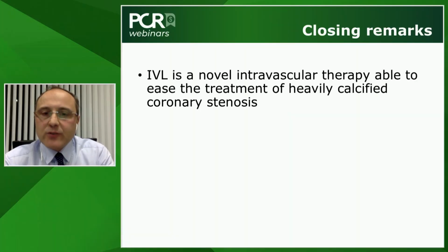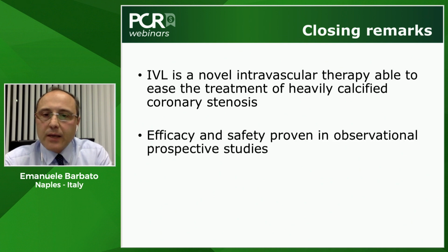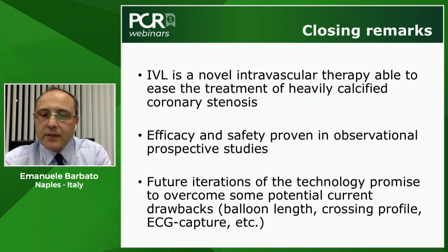Intravascular lithotripsy is a novel intravascular therapy able to ease the treatment of heavily calcified coronary stenosis. The efficacy and safety have been proven so far in observational prospective studies. We have seen and discussed in this webinar the DISRUPT CAD III, but there are two other observational studies before that which have shown the same kind of messages.